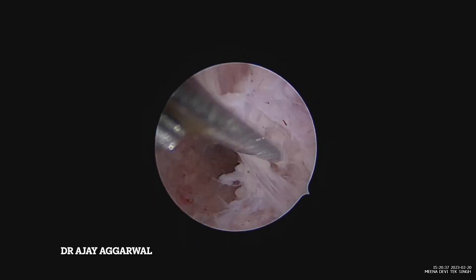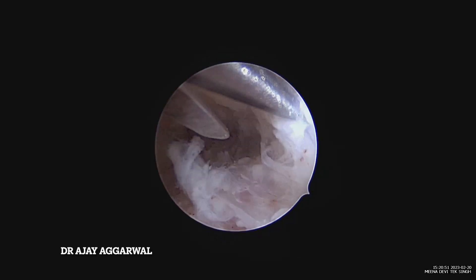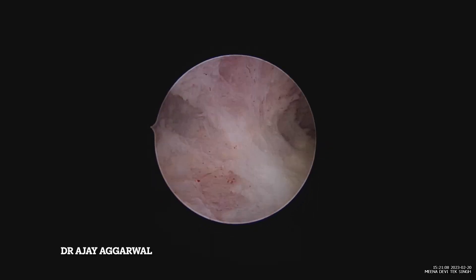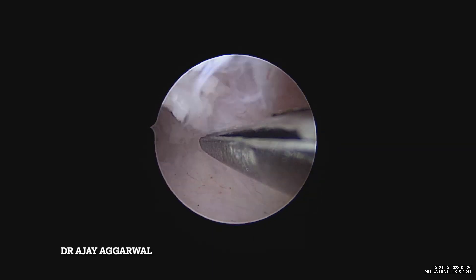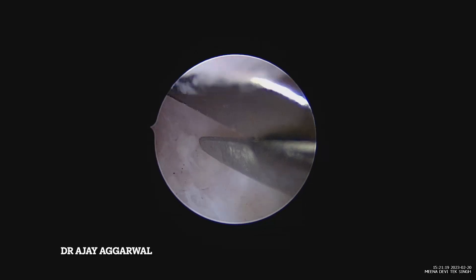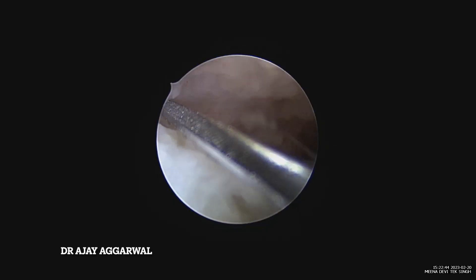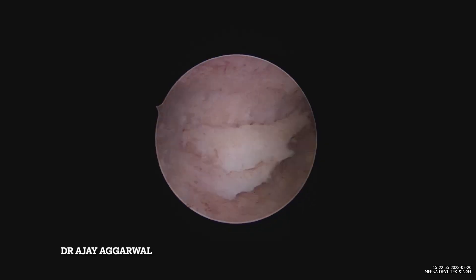After identification of the ostia towards the right side, I now start dissecting towards the fundus. The cuts are very small. One thing to notice is my scissor always stays one to two centimeters distance from the scope — I don't push the scissor too far in so that I don't lose control. I move my scope, come out, have a look, then come back in with the scissor. The entire scope assembly goes in and cuts. This gives me better control and the incisions are very fine and small.